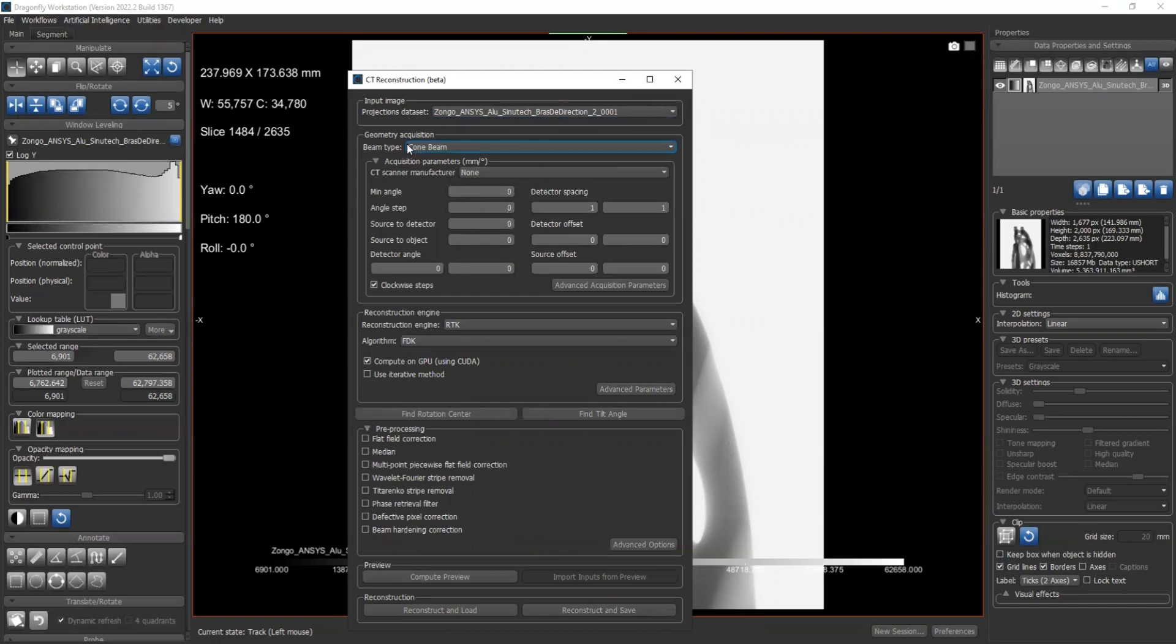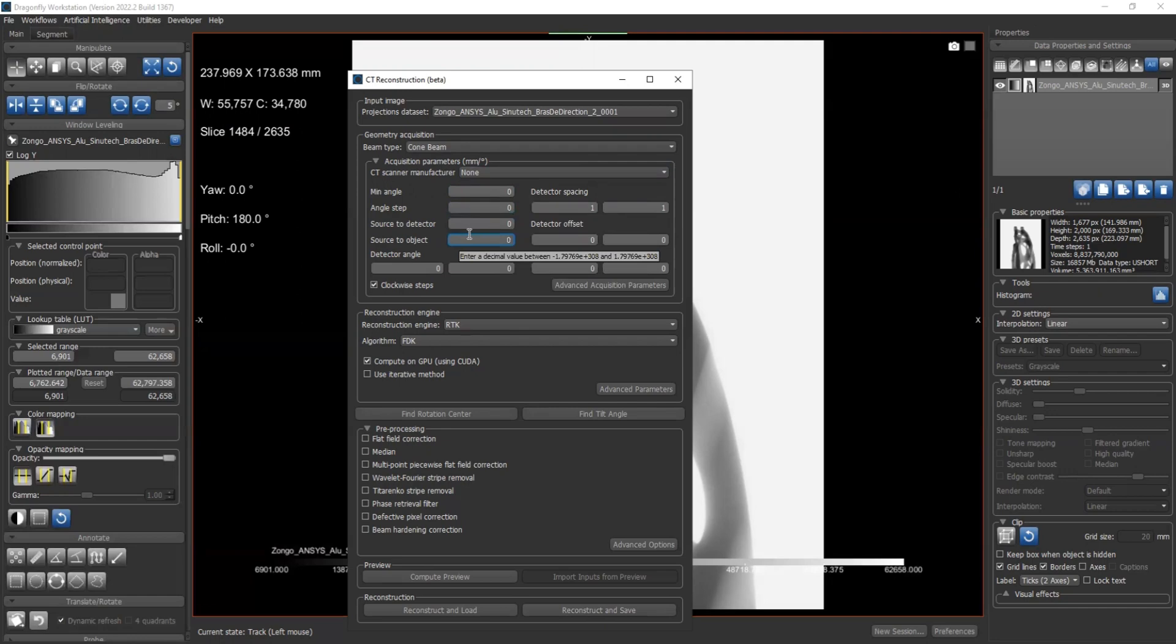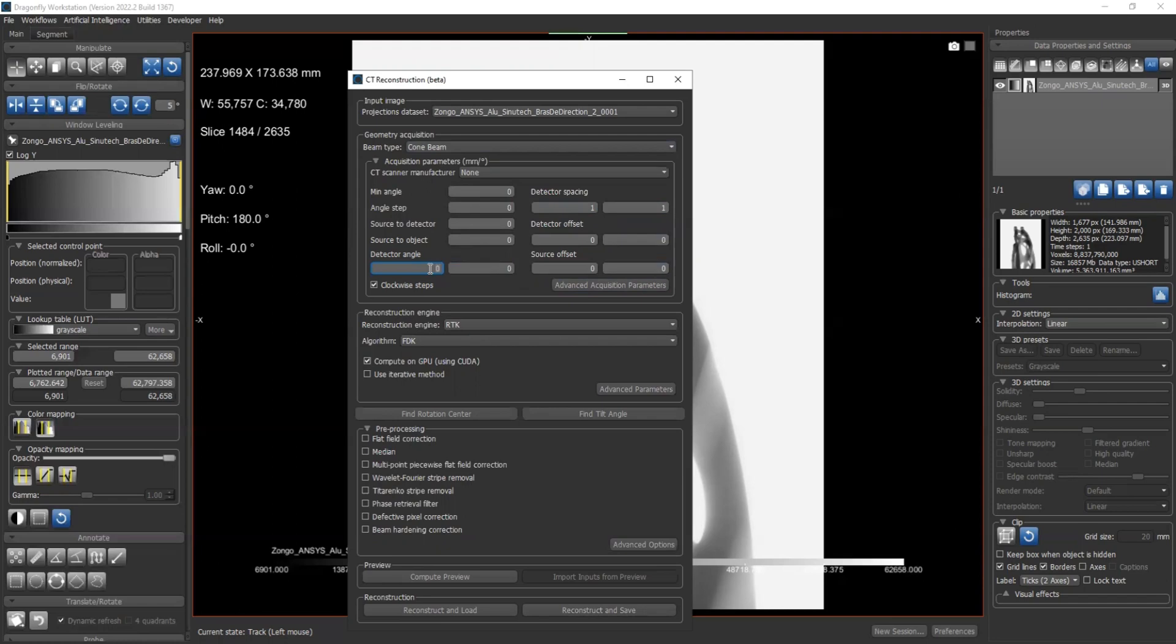So for the third step, we need to fill out the geometry acquisition part. First, beam type. Of course, it's a cone beam dataset. Now we have a series of parameters in the acquisition parameters part, including minimum angle - normally it's zero - angle step, source to detector distance, and source to object distance. On the right we have detector spacing along the x and along the y, the detector offset and the source offset along the x and along the y respectively. Also, the detector angle - the first one is in-plane angle and the second one is out-of-plane angle.